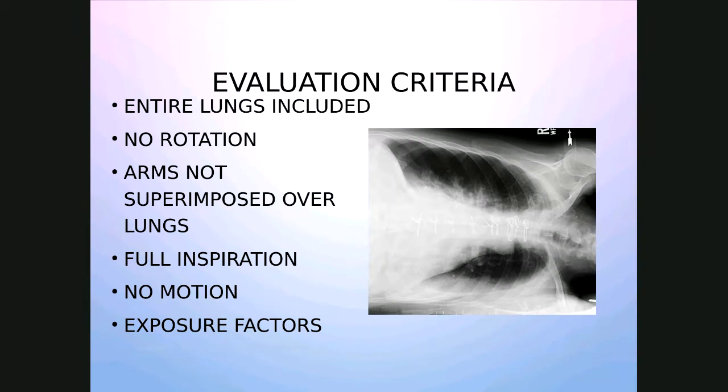So right here, this line right here is actually all of this is fluid in the left lung. So I'll get rid of that so you can see it again. So you've got fluid in the left lung, so you can see the fluid line, and then the dark is the air. So air rises, fluid falls. So this patient likely has pleural effusion or something going on.